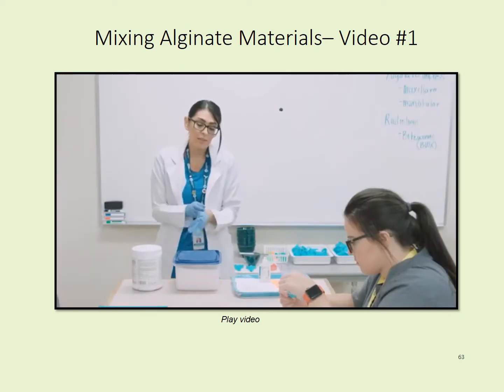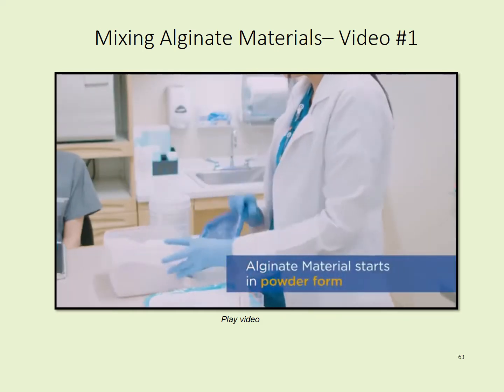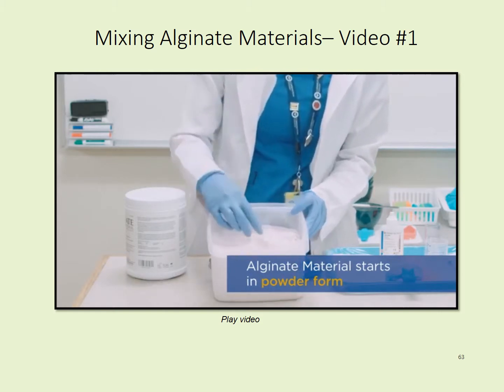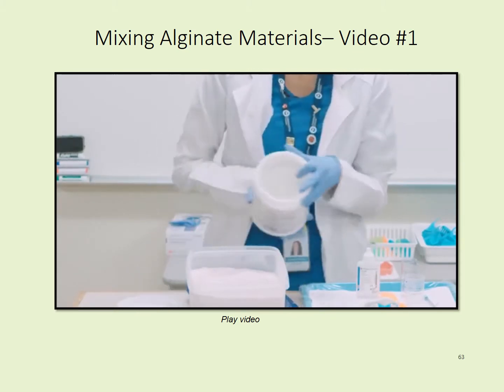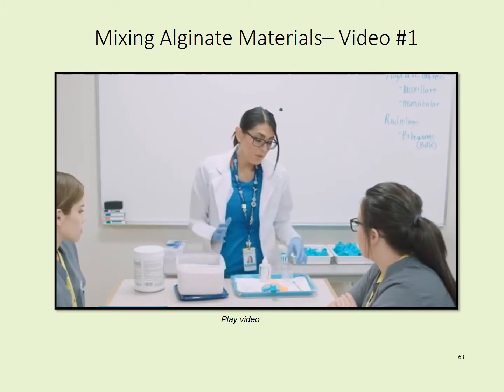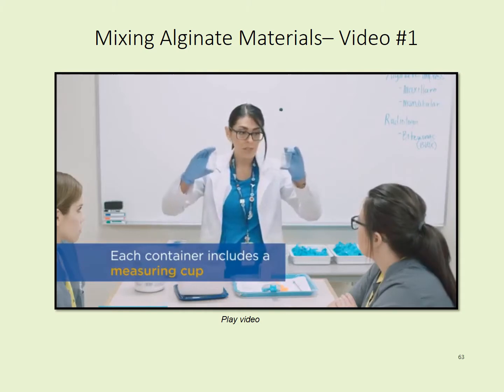So what alginate material is, it is a powder form that looks like this, and most alginate impressions have a scoop for measuring. You can also see alginate impressions that have a type of dustless powder, but we can also see that there's a scoop in there as well. With each alginate impression material with their scoop comes a measuring cup. Since these are two different materials, they have two different measuring cups.